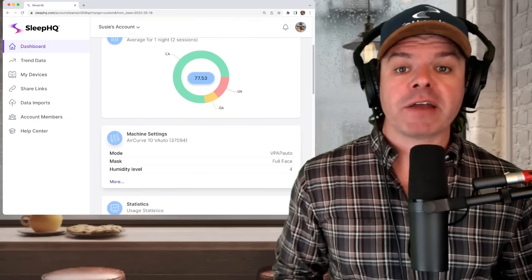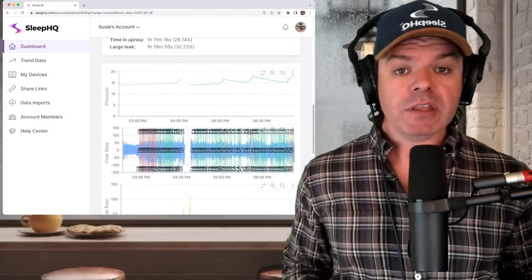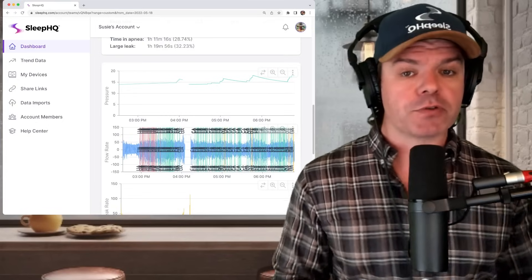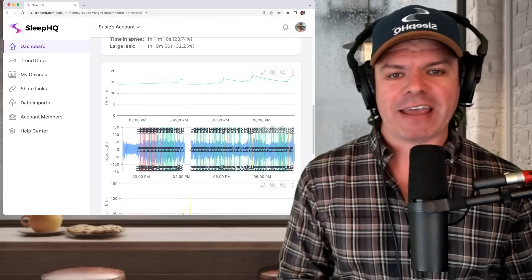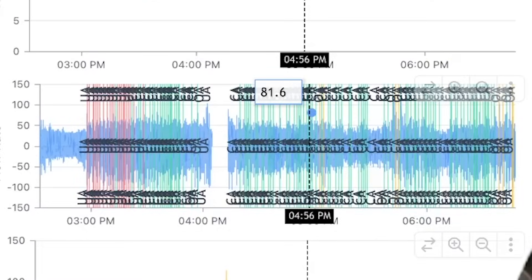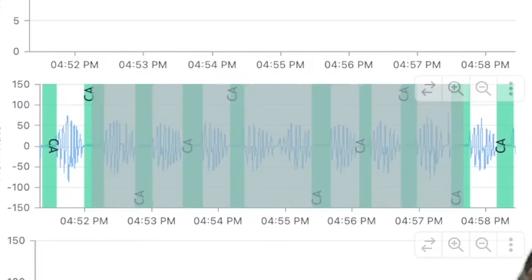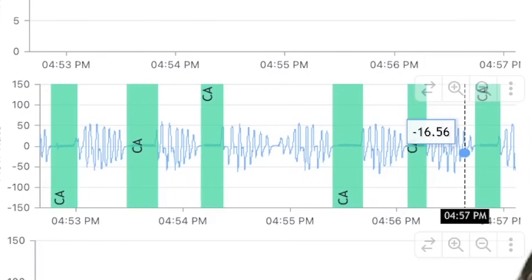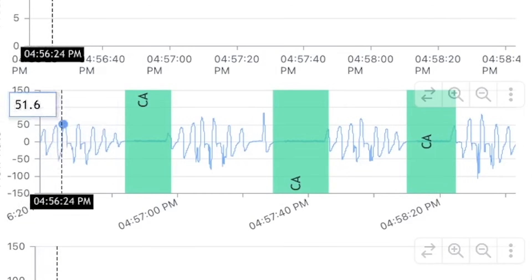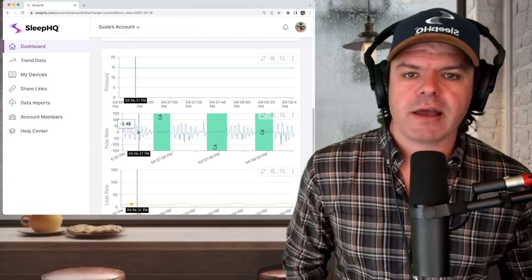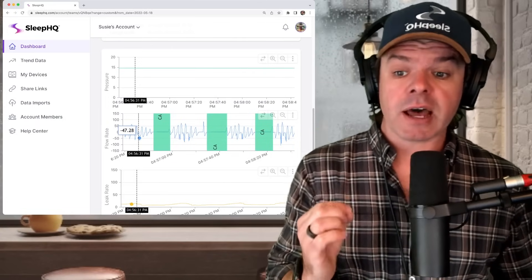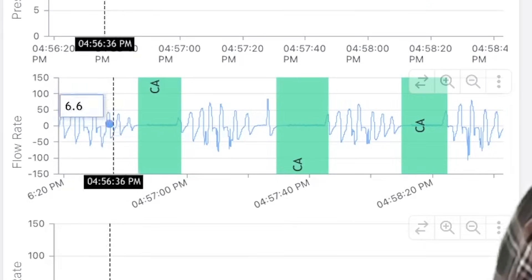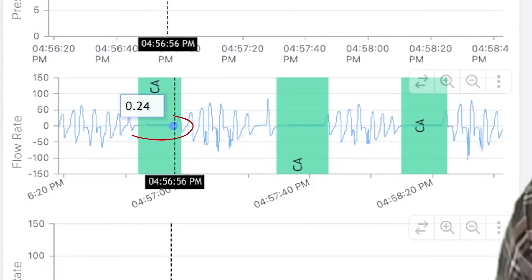And we'll have a look at this in more detail now. Let's scroll down to the flow rate. And this is by far my favorite part of SleepHQ. Having the ability to see every breath a patient takes through the night is just incredible. And you just don't get this information on your MyAir or your DreamMapper app, which are quite basic. Now I can zoom in on the flow rate by clicking and dragging my mouse like so, or I can also click Z as a hot key on my keyboard. So you can see here at the start, Fred breathing in and out, in and out. And you can see with each breath, the amplitude gets smaller. His breathing starting to get shallow. See here, they're getting smaller and smaller and smaller.